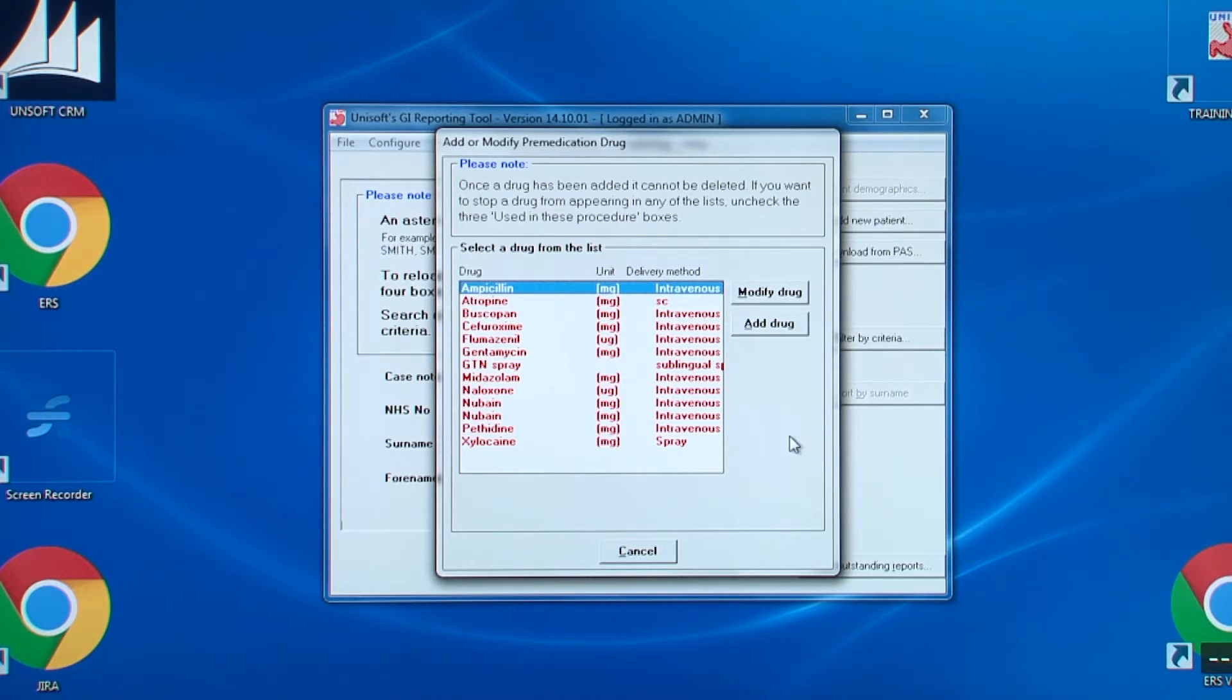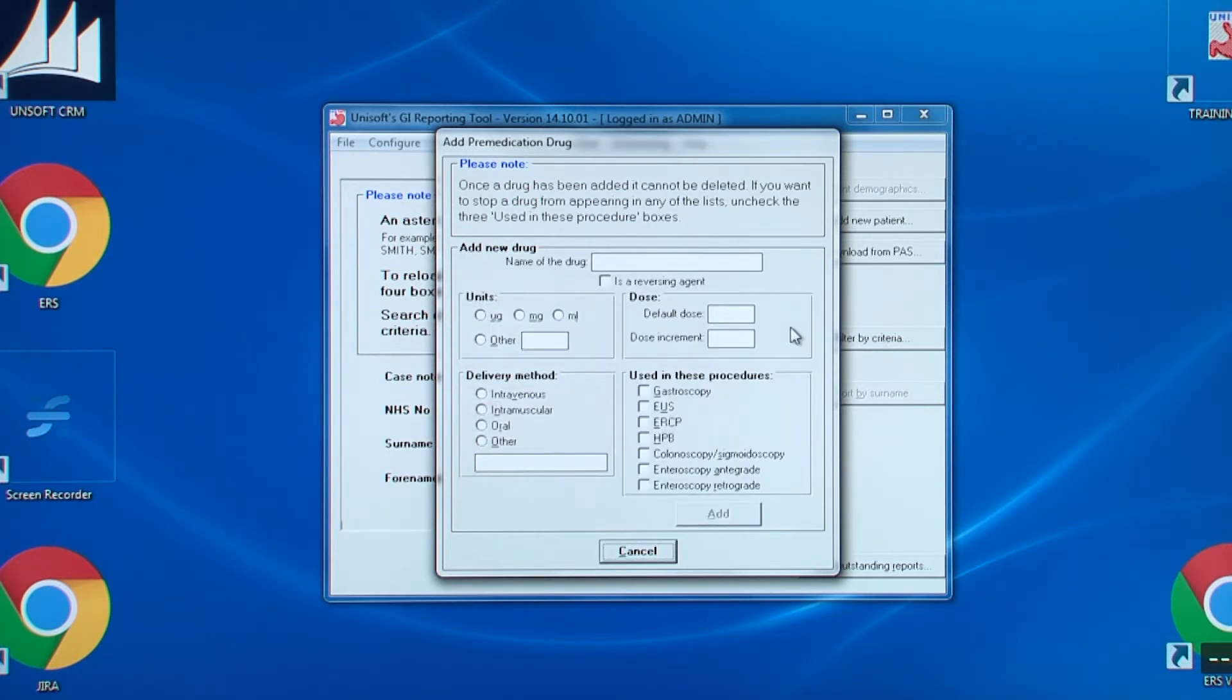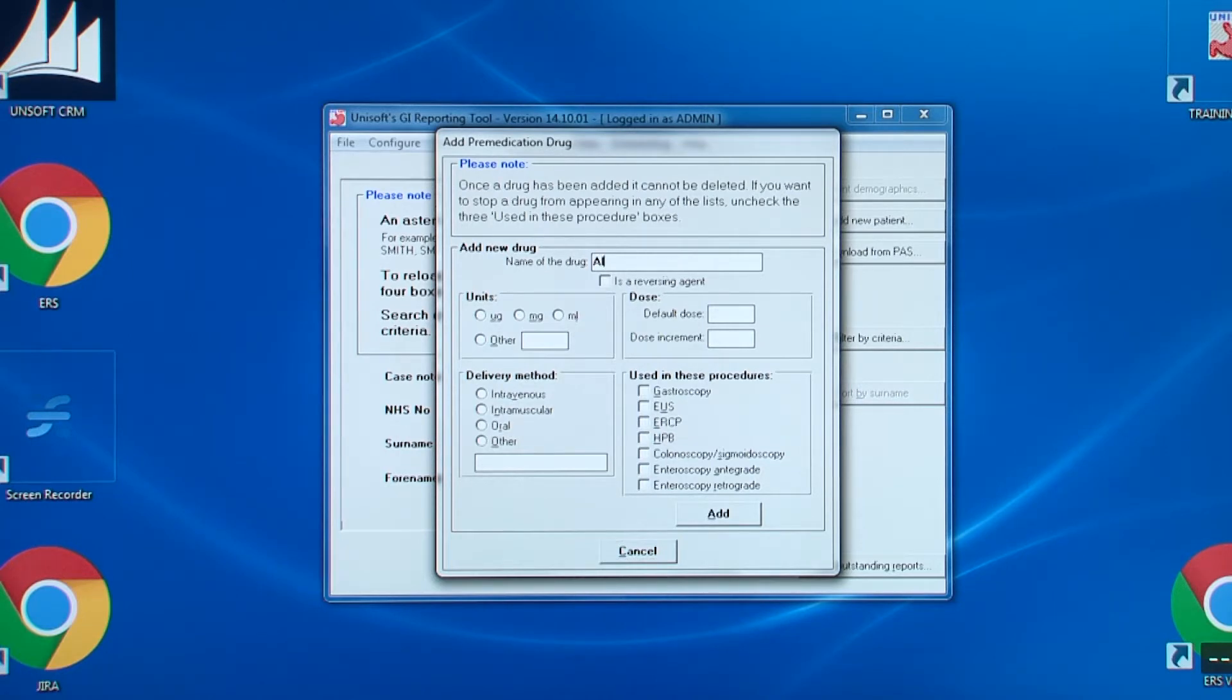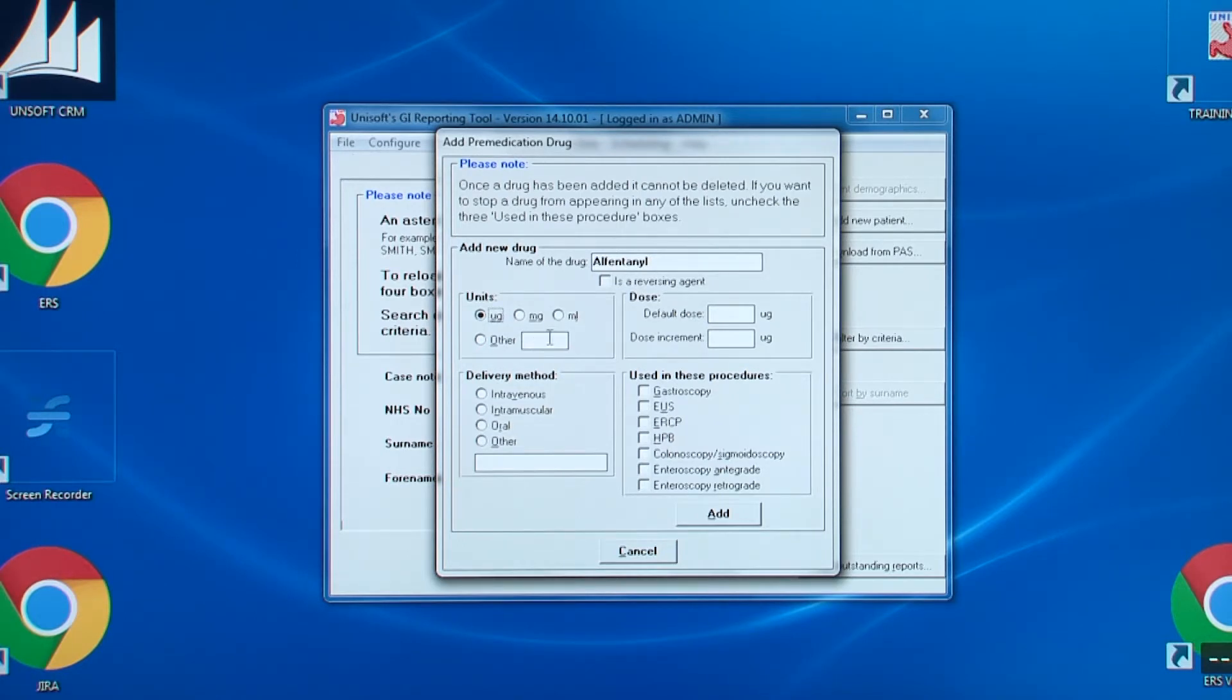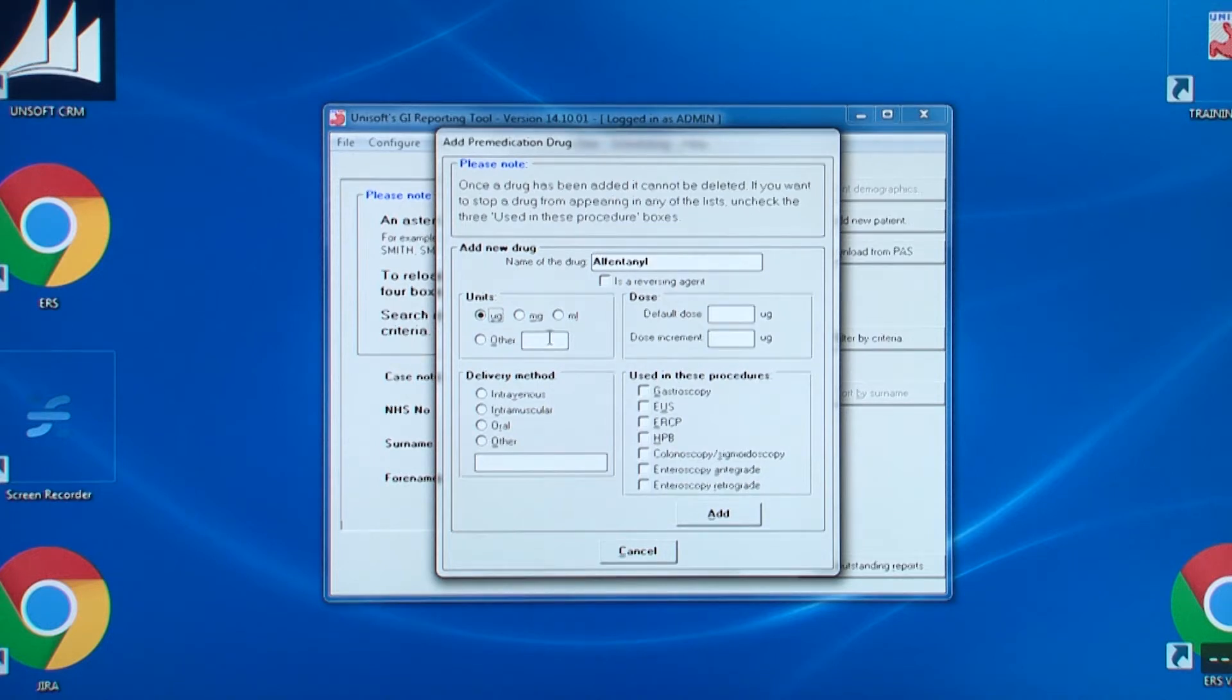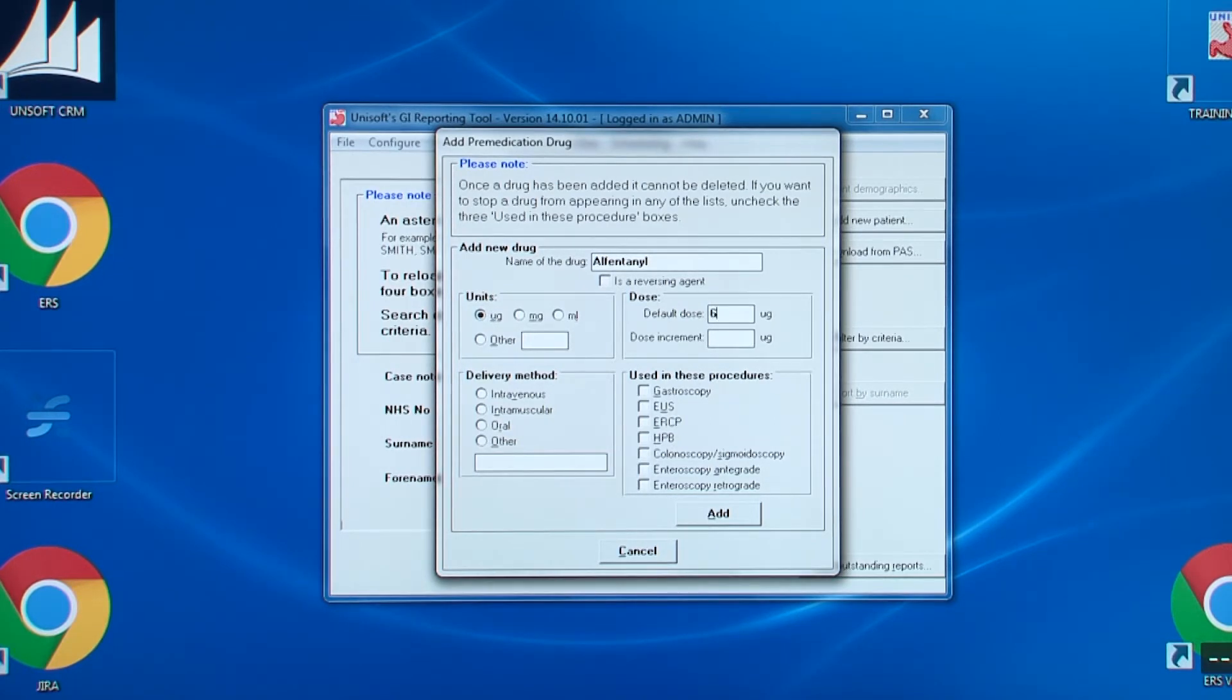There are two buttons, modify drug and add drug. Note that alfentanyl is not on the list, so let's add it. We add the name. We don't click the box for reversing agent. We select the units, micrograms in this case. The box labelled other is for other such things as gel. Then we set the default dose and by what increments the spin-up and spin-down buttons will respond to.